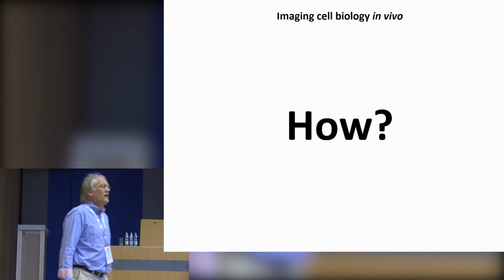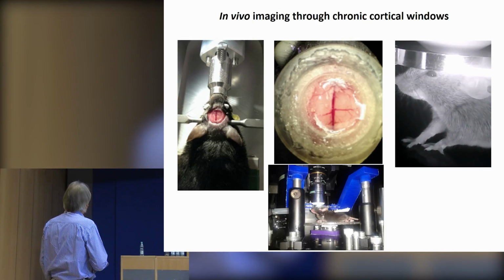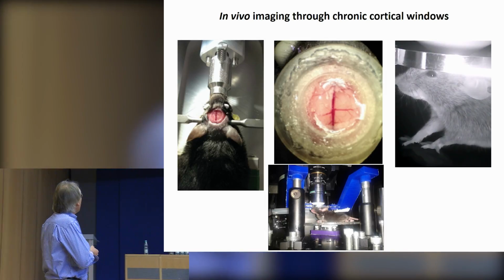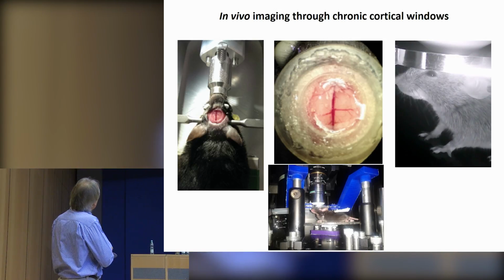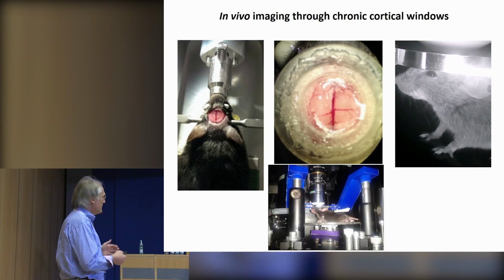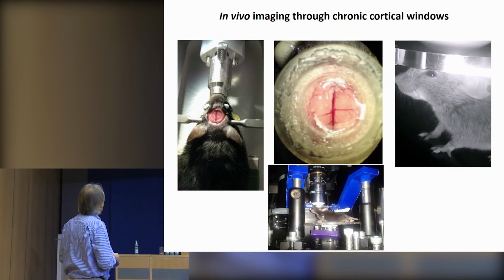I guess most of you know how one typically addresses these kinds of questions. You have to, of course, get access to the brain, so you can do a craniectomy, for example, as shown here. So you open up the skull, then insert this window here, a cranial window, and attach this crown, for example, as a mechanism to clamp the head firmly to this stage here. And you can see this mouse has been habituated to be in this situation, and you can see this disc here. So this is a turning disc. This is one of many strategies to make the mouse feel as though it's free, it can run, and that's a very important thing so that it feels happy. And so you can now basically look into the brain in the awake animal.